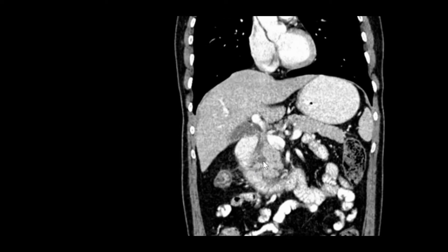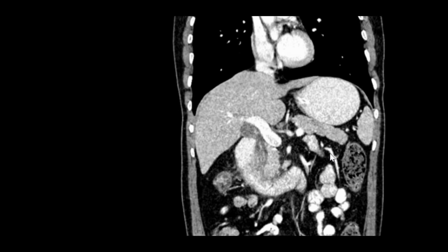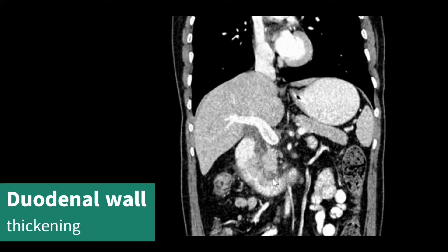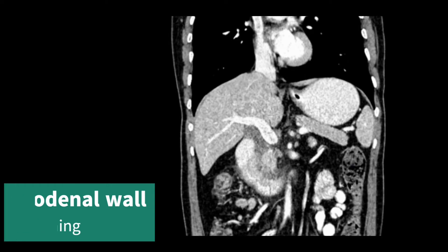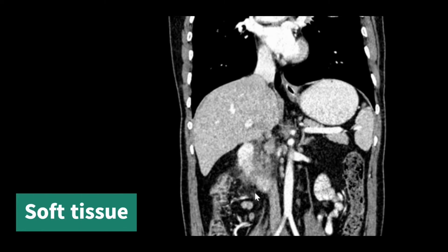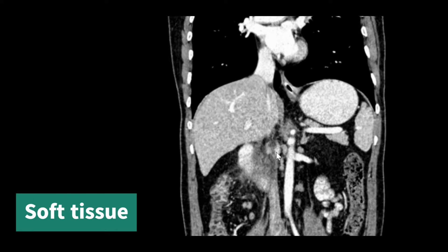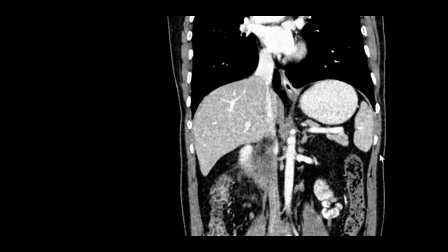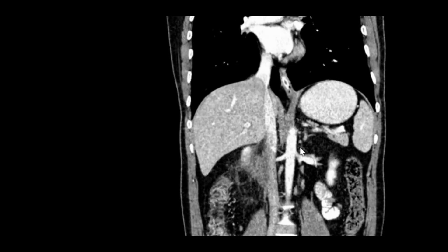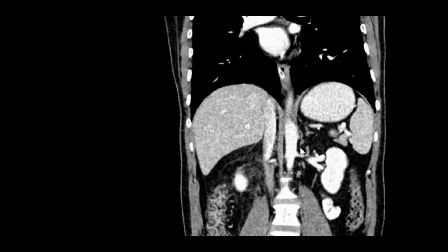We can see the wall thickening — as we move back we can see the medial wall thickening involving the duodenum. Between the head of the pancreas and the duodenum we can see that curvilinear sheet-like soft tissue density. As we move back we can also see the fat stranding, the paraduodenal fat stranding, and there are some lymph nodes in the paraduodenal location surrounding the pancreas.